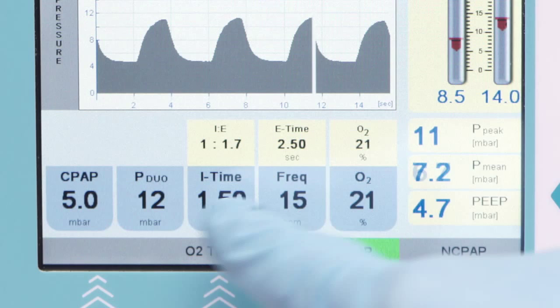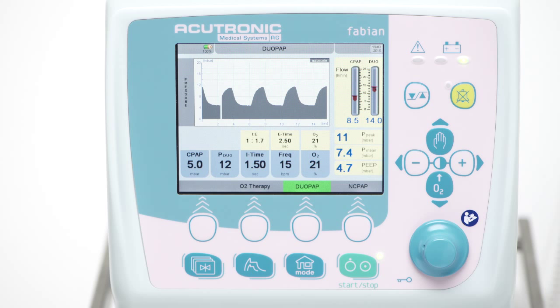The measured values of CPAP, PEEP, PEAK, and mean airway pressure are displayed on the screen.